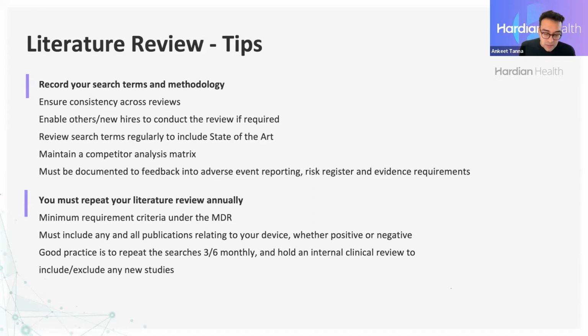It's really important to maintain a matrix of possible commercial competitors or equivalent products, not just for the purposes of regulatory and safety, but also for product strategy. And again, it's really important to document adverse events and think about how that feeds into an update of the risks and benefits of your device.